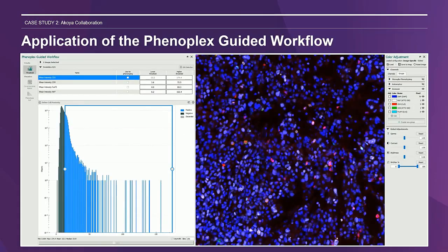We imported the cell object data into Phenoplex for a streamlined process of fine-tuning thresholds per marker. An image cell panel is shown here for CD3, CD8, FOXP3 and Ki67. In combination with the colour adjustment menu, we can easily review thresholds and adjust them using the histogram slider to ensure we are detecting true positive cells.